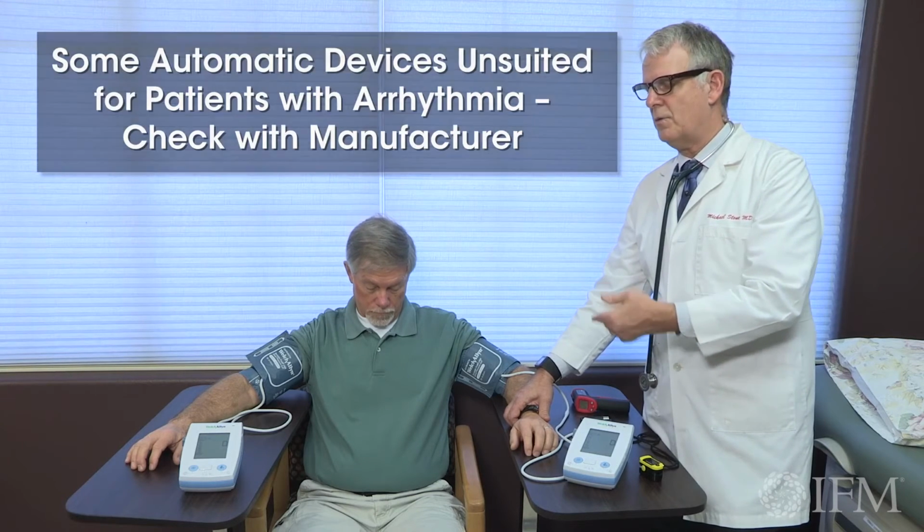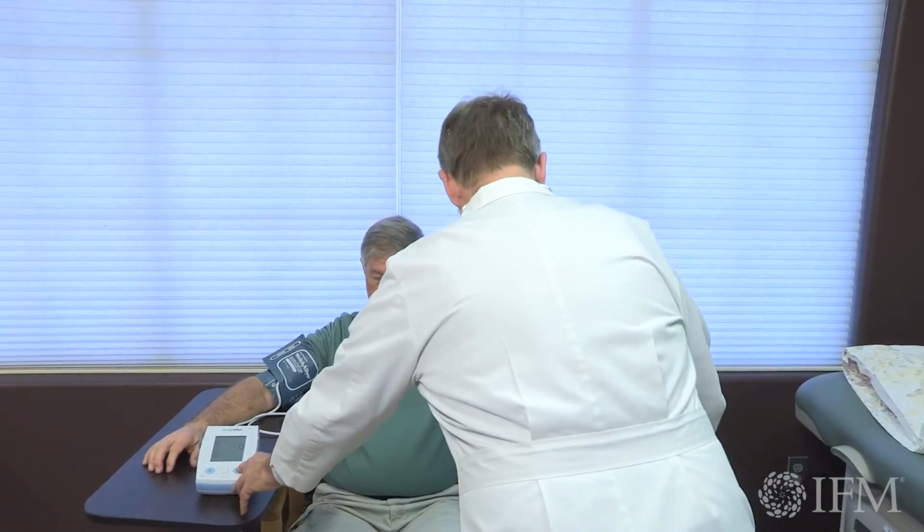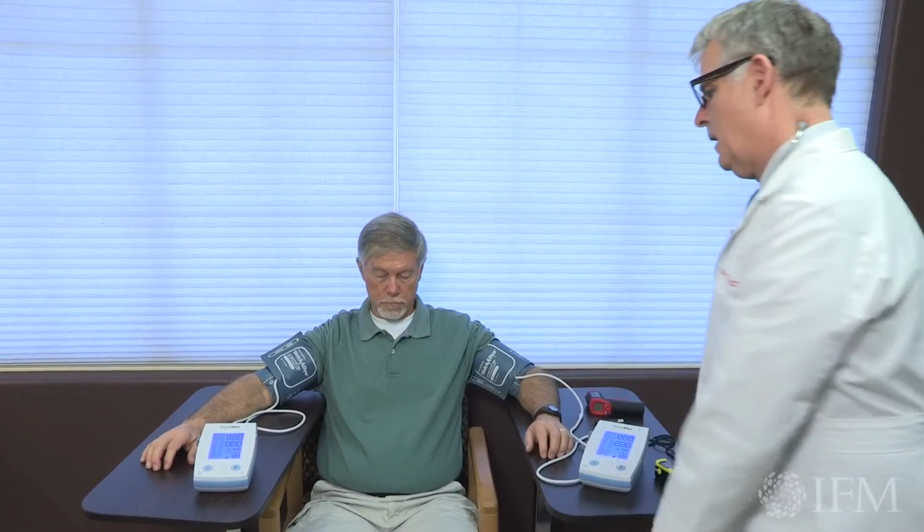If the patient does have an arrhythmia and you do want to check to see if the blood pressure is the same on both arms, you're just going to have to do manual determination in series. But let's go ahead and do this here. And while it's calibrating and determining, this is also the opportunity to consider what are the other nutritional things that might be playing a role.